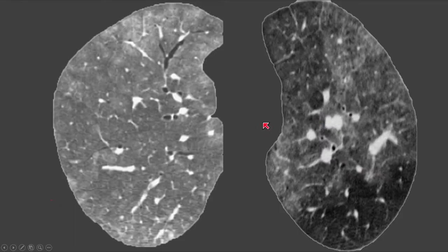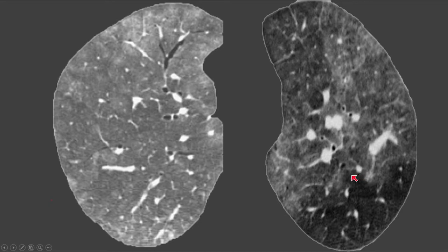Looking at a CT on the left, there is a mosaic attenuation abnormality with areas of dense and lucent lung. When we look at the lucent lung, the vessels within it are generally smaller in size and less numerous than the larger and more numerous vessels within the denser lung. That implies the lucent lung is abnormal — this is a mosaic perfusion abnormality.